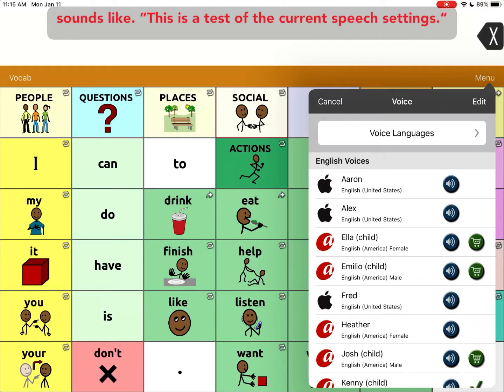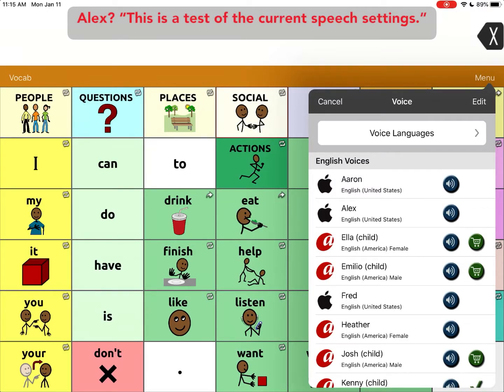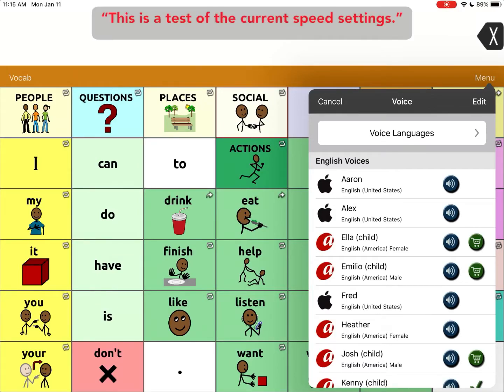I can choose and preview the voice. Let's see what Aaron sounds like: 'This is a test of the current speech settings.' So that's what Aaron sounds like. What about Alex? 'This is a test of the current speech settings.'